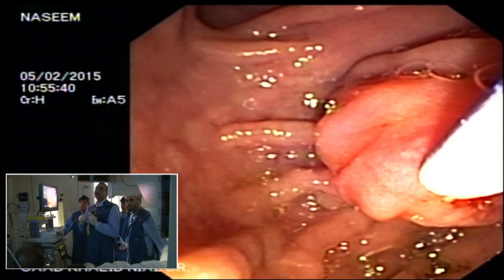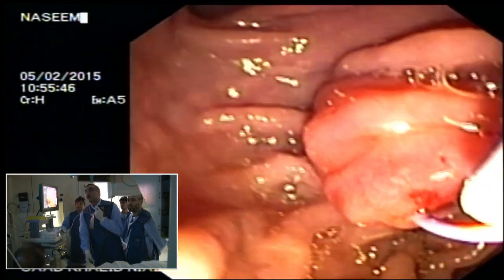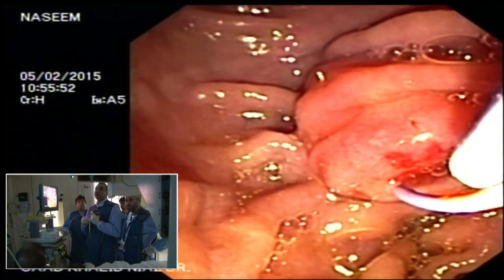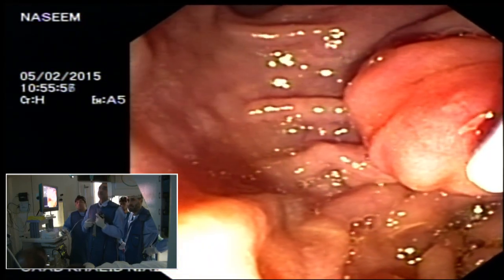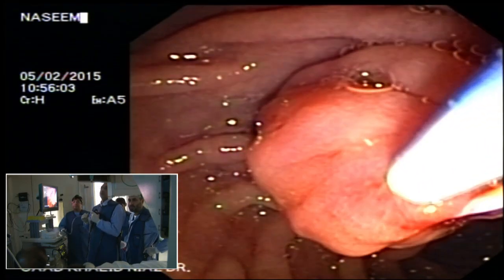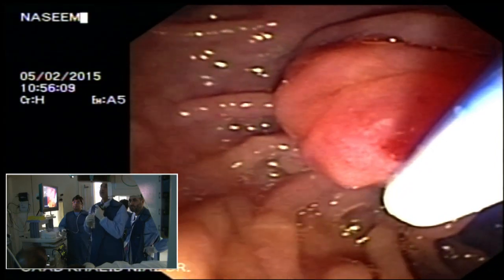Yeah, that's what I'll use. We'll use the pancreatic wire as a guide, and I'm just looking at what would be the best direction of cut. Because the papilla is a bit twisted, if you look at it, even the pancreatic duct is not in the expected position. So I just want to make sure that we make the correct cut. You have to remove tension from the pancreatic wire.